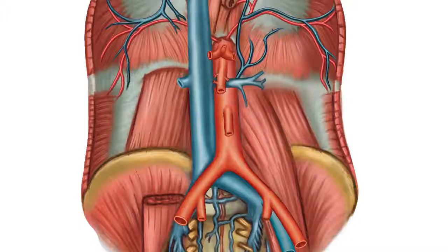We're going to review the abdominal aorta for ultrasound examination. The abdominal aorta is everything between the diaphragm and the iliac bifurcation. When we scan the abdominal aorta, we're looking for focused pathology, namely the presence or absence of an abdominal aortic aneurysm.